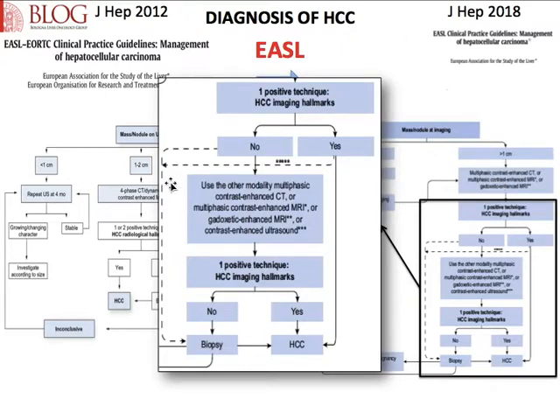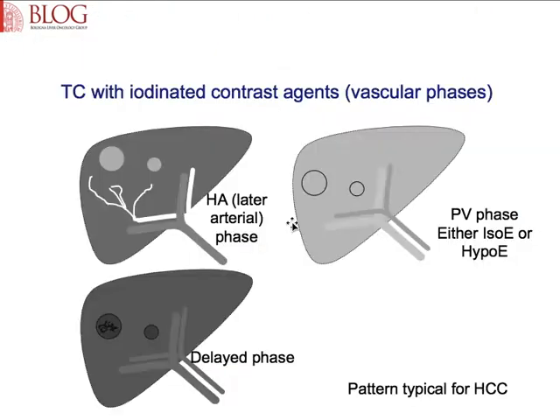But if this is inconclusive, they accept either resorting directly to biopsy or going to an alternative technique, which includes also contrast-enhanced ultrasonography, which is therefore endorsed as a technique able to definitively achieve a diagnosis of hepatocellular carcinoma. So the different definitions for the typical hepatocellular carcinoma are, for CT, the presence of hyperenhancement followed by washout, either in the portal or in the delayed phase.